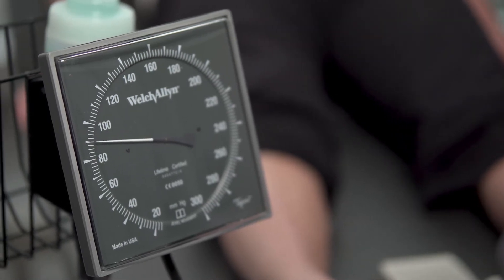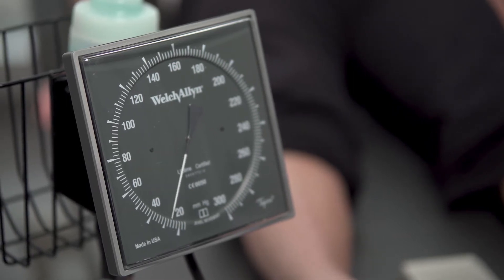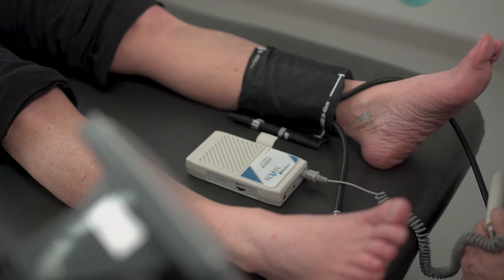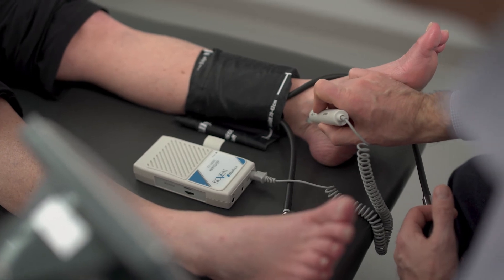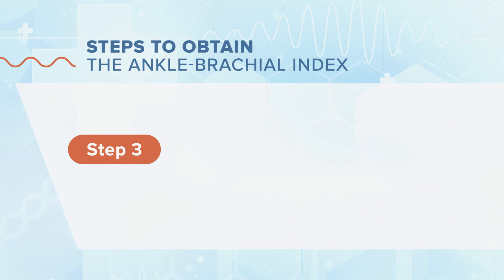In this case, the systolic pressure is also 130 millimeters of mercury on both arteries. We then have to measure the pressure on the left leg. Using the same technique, we obtain a systolic pressure of 90 millimeters of mercury on the left leg.